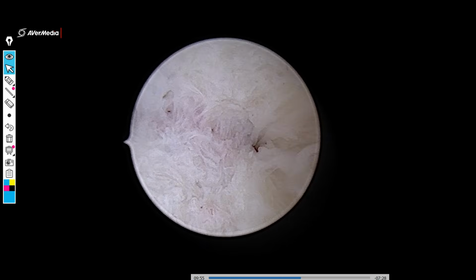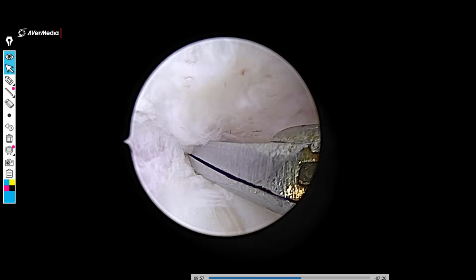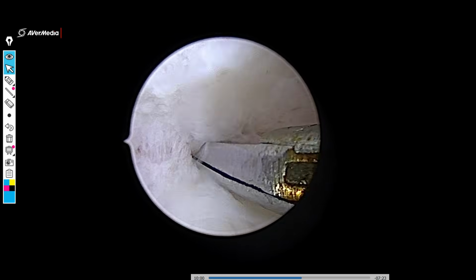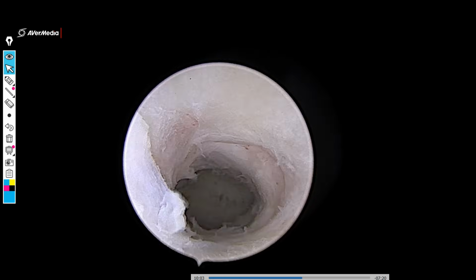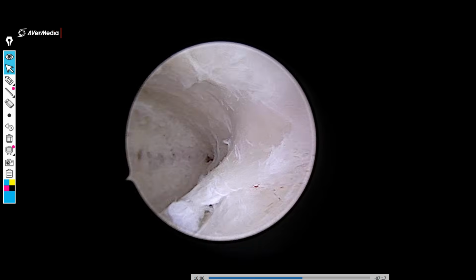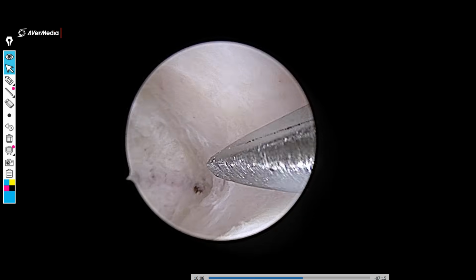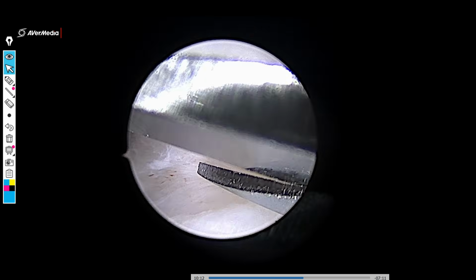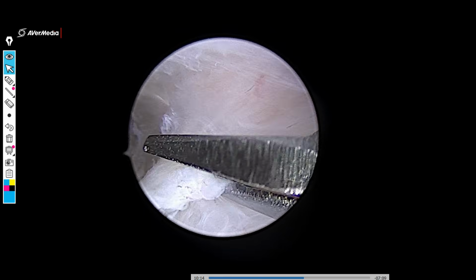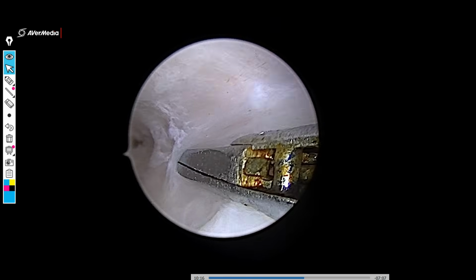It is so much more spacious compared to what it was before, almost like a near normal cavity. Also, the appearance of this ostium is nearly like a normal ostium, and appreciate the shape and size of the cavity now, which has become quite big. Now, we need to understand that these synechiae are not always present only as anteroposterior bands.